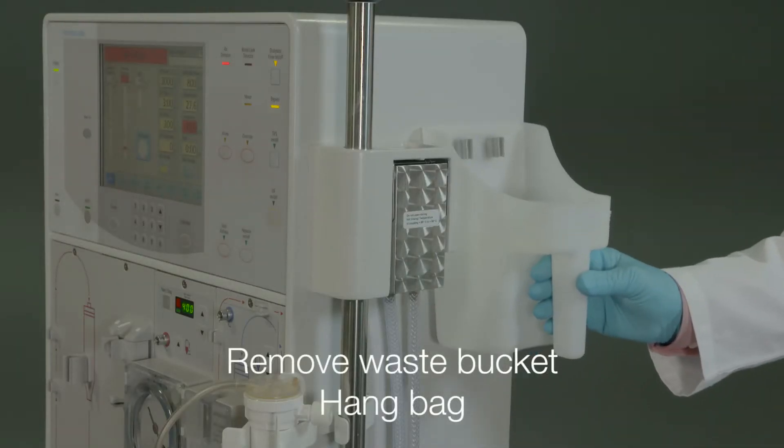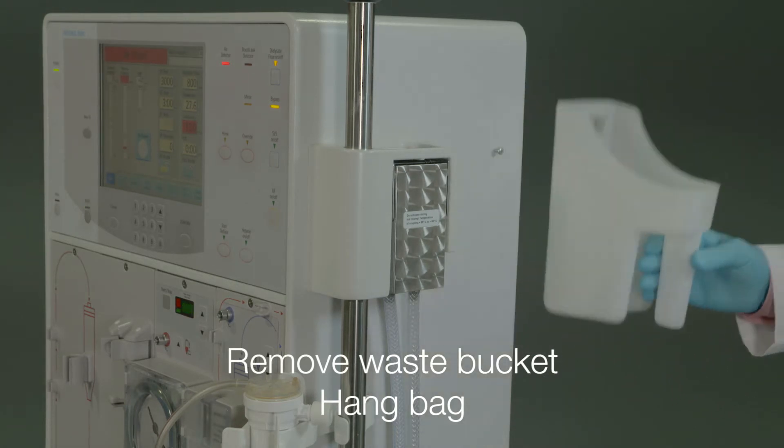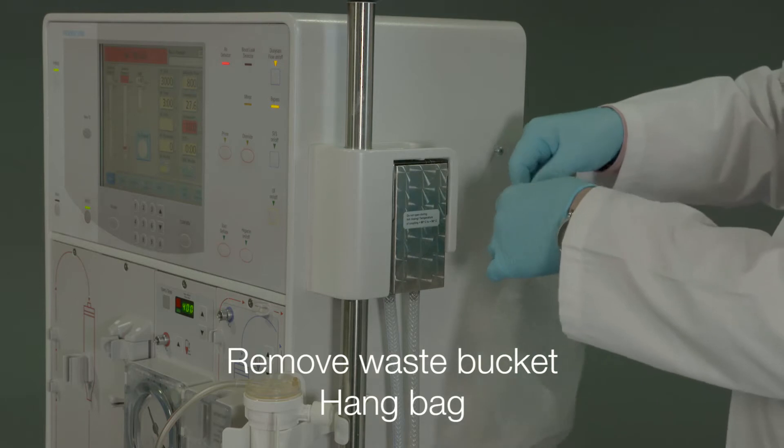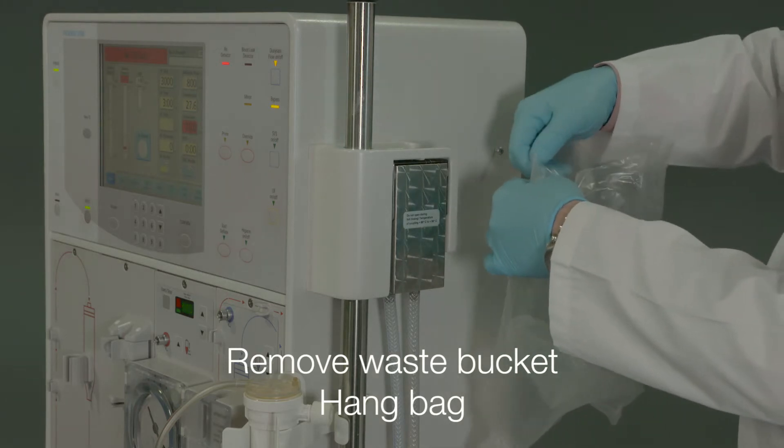With Streamline Express, priming waste buckets are not required. Slits have been added to the packaging bag so that it can hang on the machine as a receptacle for plastic caps and coiling tape.